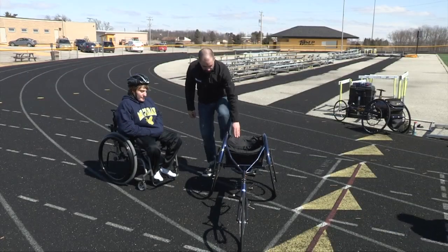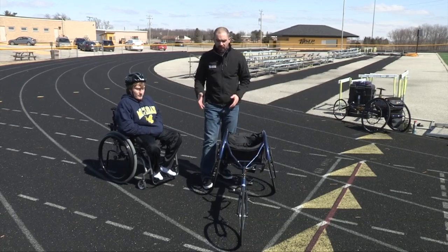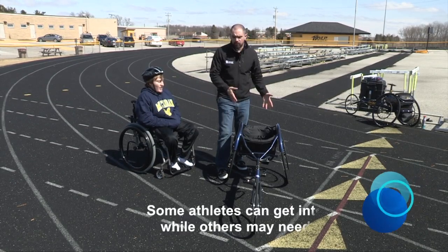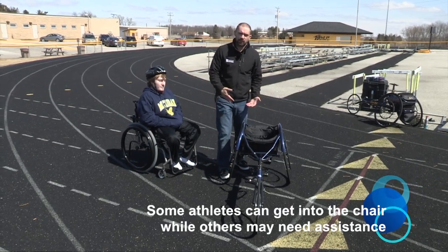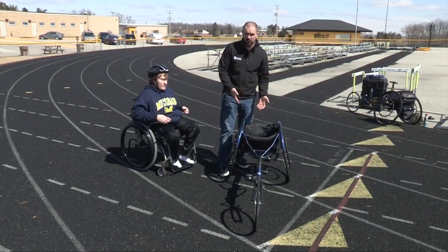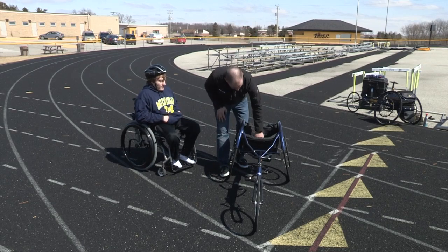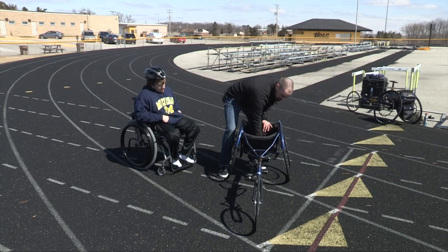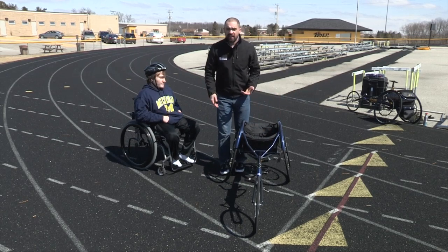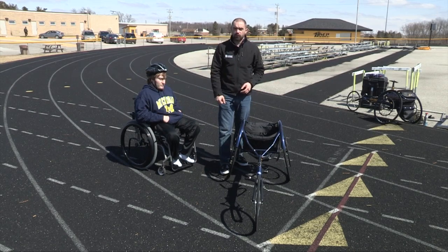Transferring into the chair can be a little bit difficult sometimes. Depending on the ability levels of the athlete, some of them can do it independently, others need a little bit of assistance. Today we're going to be working with Jordan and he's going to be getting into his racing chair. He sits in a kneeled position, so his knees will be sitting here with his feet down in the pocket. The way that he prefers to get in and out of the chair is we're going to bring the chair up in front of him, open it up, and he's going to transfer into it.